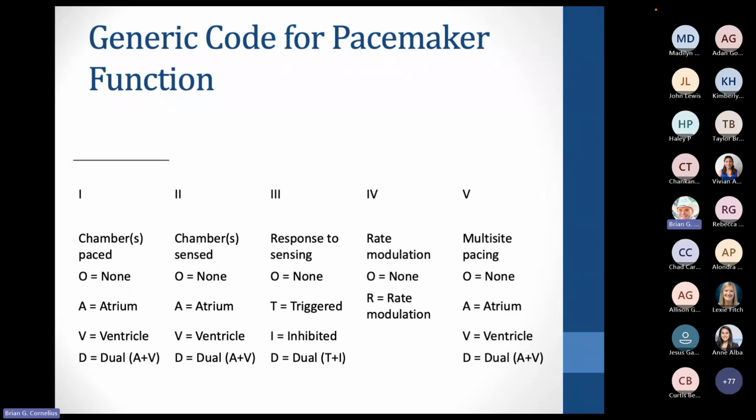A lot of times you can ask the patient, or you may have to do a physical exam to look around and see if you're able to locate the generator itself. So in those cases, you may have an atrial sensing, you may have a ventricular sensing, or it may do both. So just be mindful of what kind of device you have, what it's going to do.